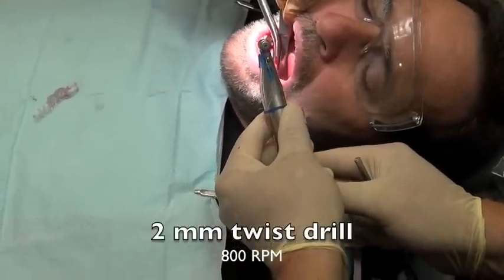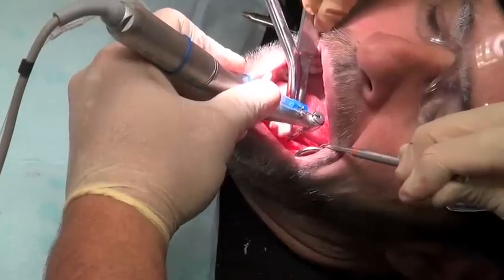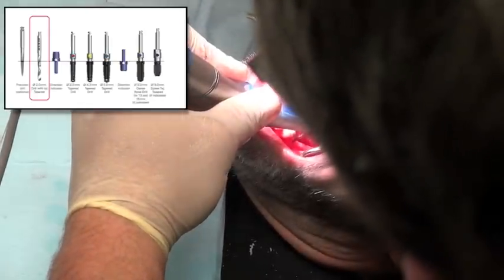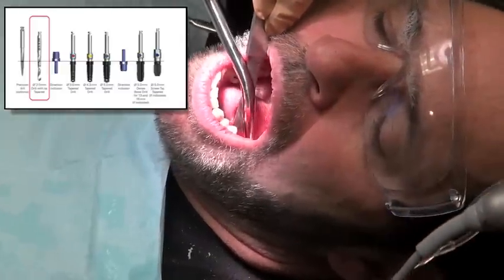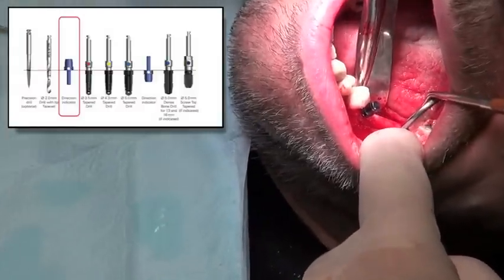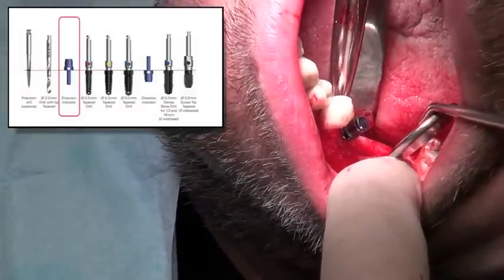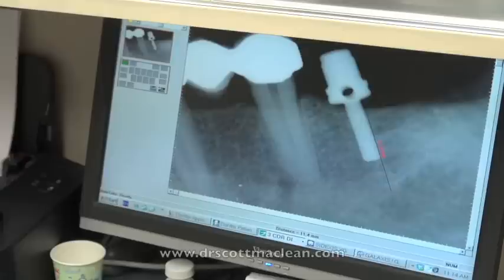We can go back in now and use the 2mm twist drill. We'll take this approximately down to about 8mm so that we're able to place the direction indicator next to give a look at the angulation and the depth. Those are two key words in implant dentistry — angulation and depth. Once we place the direction indicator in, this is going to tell us how far we are from the adjacent tooth, how deep it is, and we can measure down to the nerve to make sure we're okay.